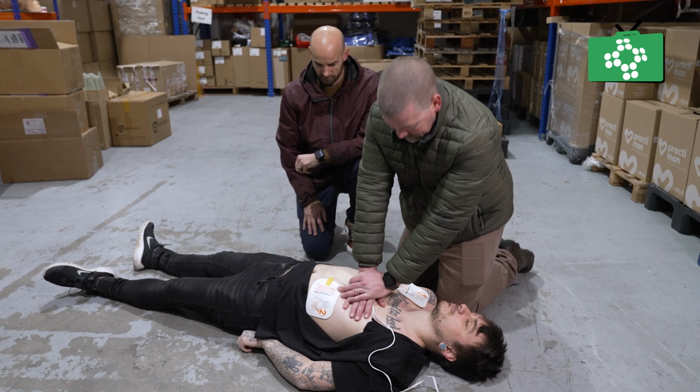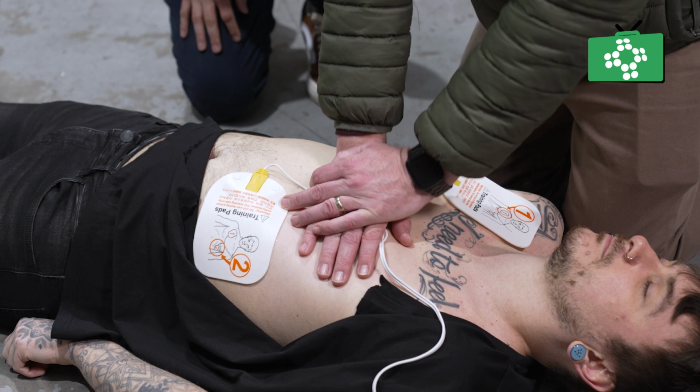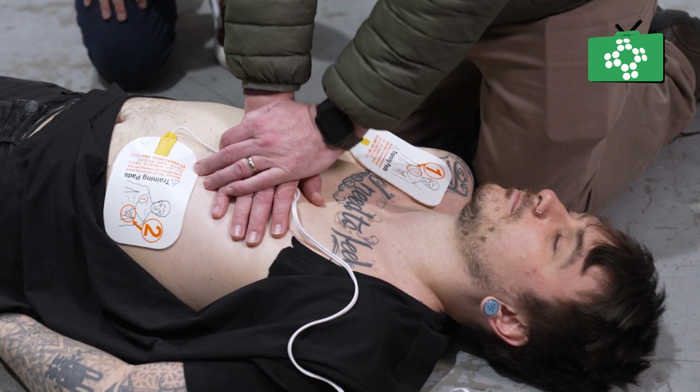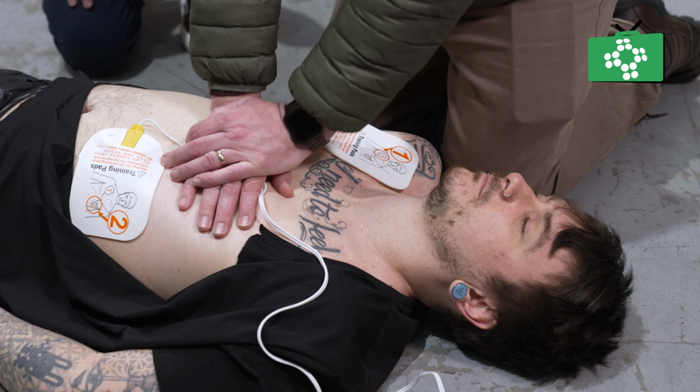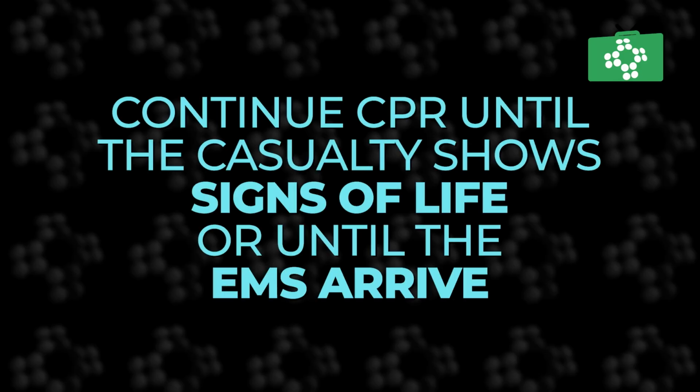Using an AED quickly can increase the victim's chance of survival and it's essential to apply the AED as soon as possible. Using an AED may sound frightening, but they are easy to use and you could save the person's life. Stay calm, follow the voice prompts, and trust the AED to guide you until medical professionals arrive. Finally, this film is about this brand of AED, but all AED units work in a similar way. So if you're not familiar with the brand, turn it on and follow the voice prompts.